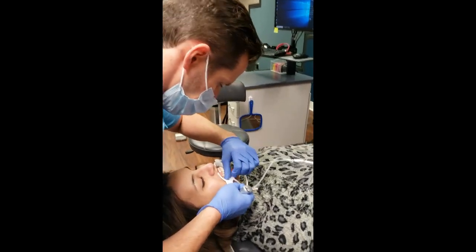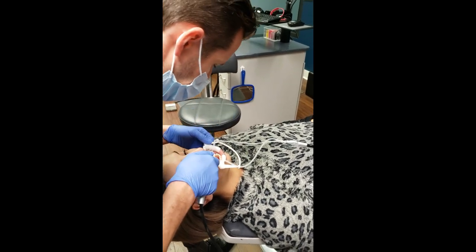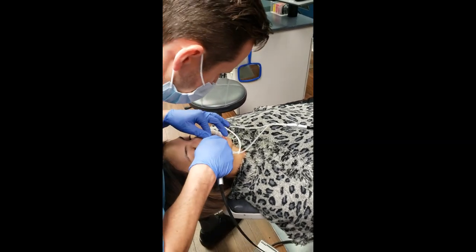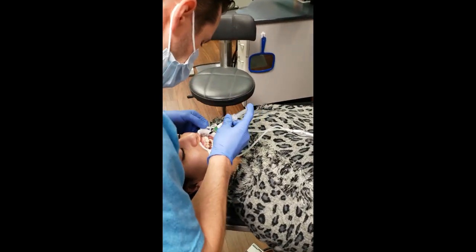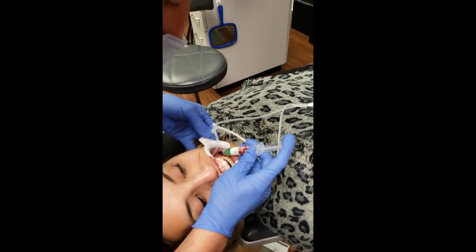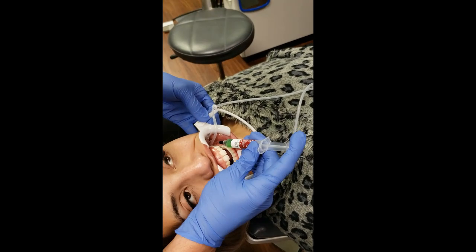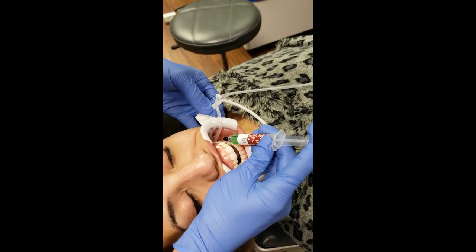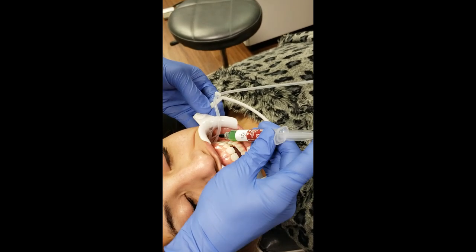Before we etch - because it's a gel - we have to make sure the teeth are dry, otherwise it might dilute the gel and we might not get as good of an etch. I'm going to etch the sixes now. Ideally I want to place it right in the center and as gingival as possible - not sub-gingivally, but so that the patient is not going to bite on it, because 90% of the time when they break something that's where it happens.